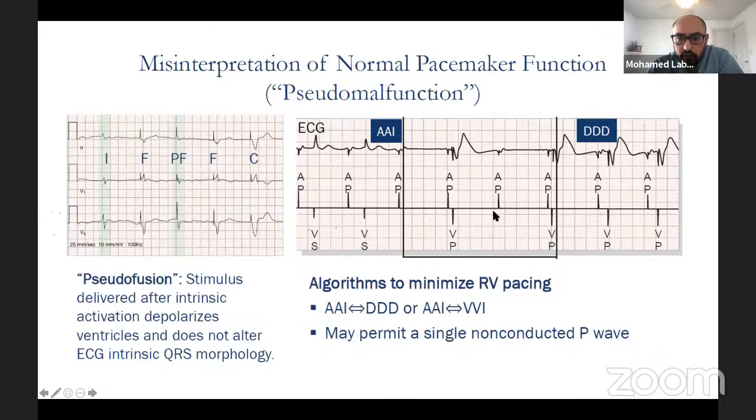If you don't see a lot of V, or you don't see the A tracked by the V, then you switch to DDD. This is the MVP algorithm that Medtronic uses. You usually say 2 out of 4. That is, if you have 2 dropped beats out of 4, you turn on the MVP mode. Dr. Fathi Idris and Khaled Bouzguia, any comments on this? Basically, it's the algorithm to reduce RV pacing. That's the bottom line.